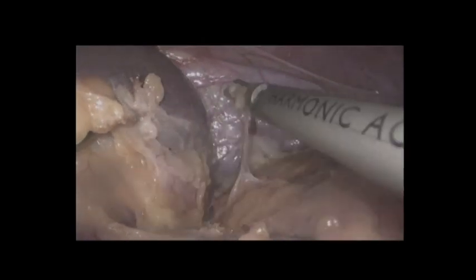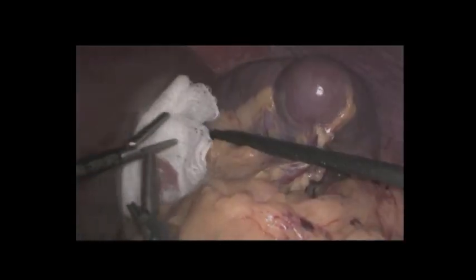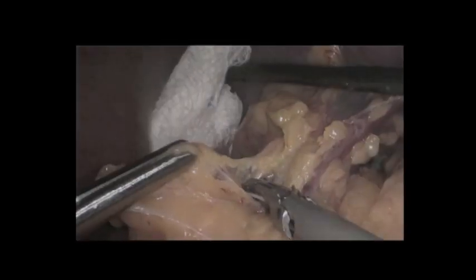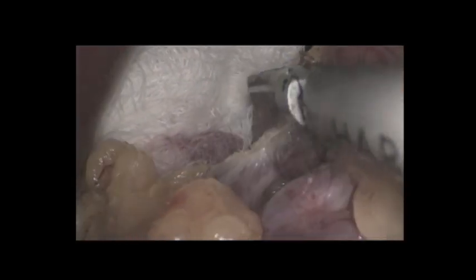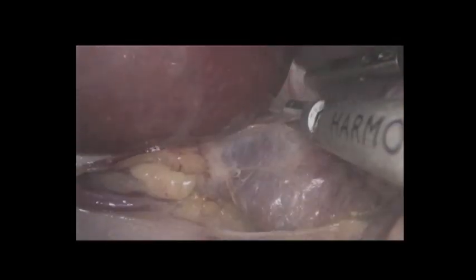So then the spleen was mobilized and a 4x4 was introduced to provide anterior traction of the left lobe of the liver. So now the gastrosplenic ligament was exposed, and the assistant provides lateral retraction of the spleen, and the short gastric vessels were taken down with the harmonic scalpel. So finally, the spleen was freed from its attachments. And you can see here the gastrosplenic ligament was taken down.